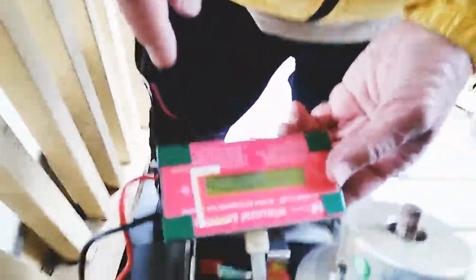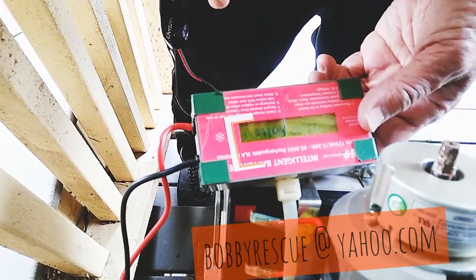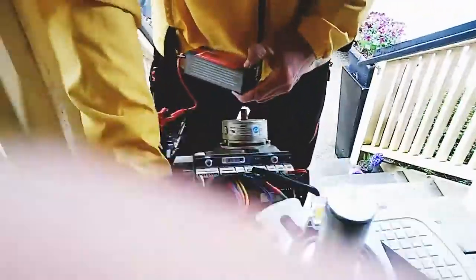This way? Okay. That's the temperature. 6 to 30, 0.87, 4 amp hours. Okay, that's good. That's awesome.